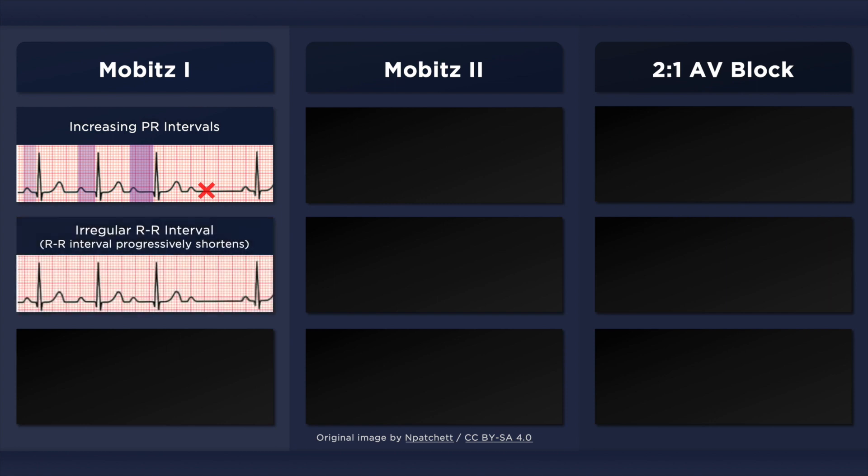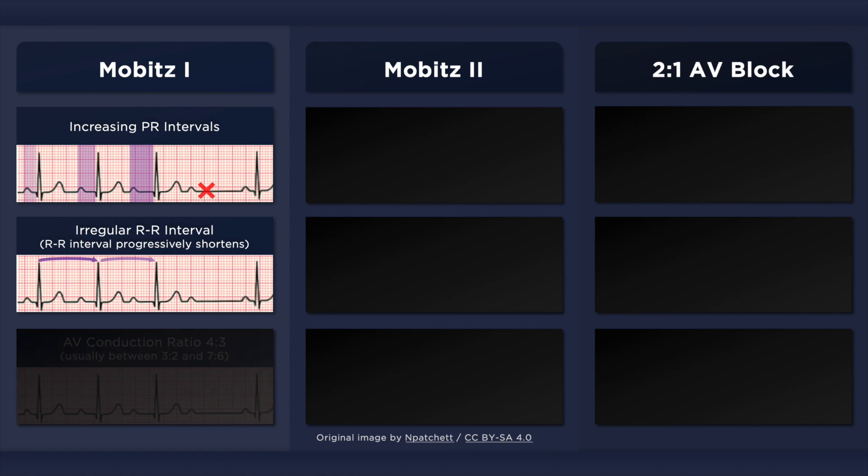Another finding typical of Mobitz 1, which is hard to appreciate in this illustration, is an RR interval that progressively shortens. The RR interval is the longest following a drop beat, and then shortens with successive beats until an atrial impulse fails to conduct to the ventricles. The ratio of atrial impulses that are conducted to the ventricles is usually between 3:2 and 7:6. However, this ratio can vary between cycles. Nonetheless, each group begins and ends with a P wave.